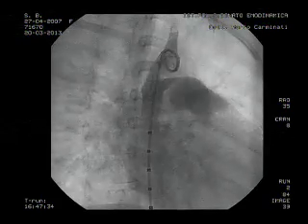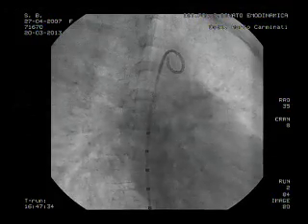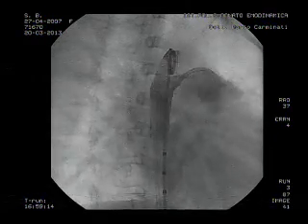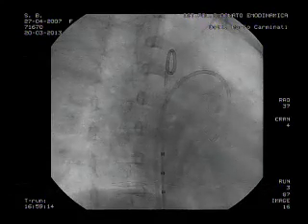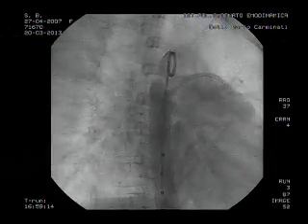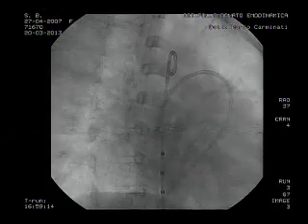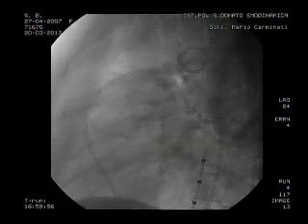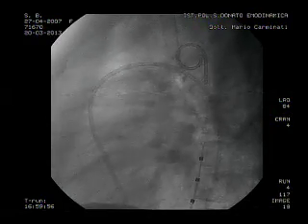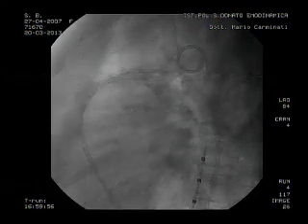That's an elongated ampulla with a pretty large shunt. We did some measurements as well. We crossed the duct very easily from the right side. This is a 6 French catheter from the venous side to the descending aorta. And you see, in spite of the catheter inside the duct, injecting the aorta, you see a pretty good amount of shunt in spite of the catheter through the duct.